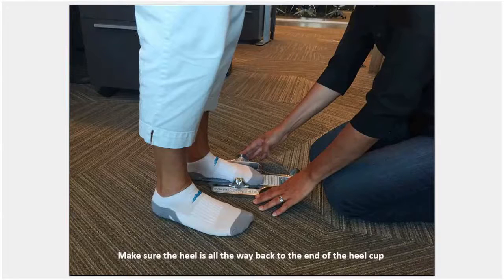So this is a good example that shows how you should properly measure someone. Helen is standing while Joanne is measuring her, and Joanne has made sure that her heel is all the way back into the heel cup. So oftentimes I'll hold the Brannock device and gently push that person's heel all the way back. You want to move jeans or pant legs out of the way. You want to find the bunion area or the big toe ball joint and put that right on there. You want the pointer to rest right in the middle of that big ball joint.